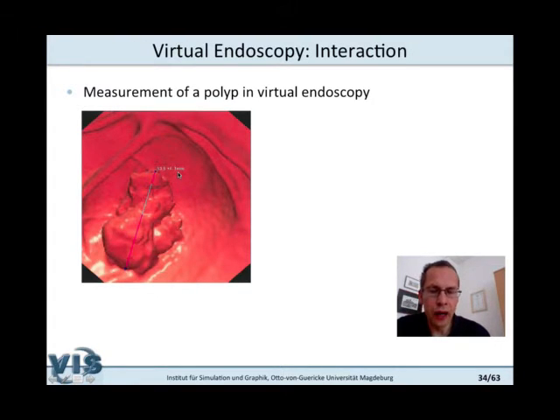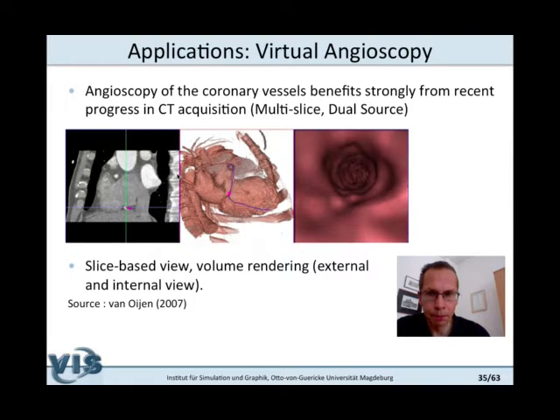Yeah, so optimally such information should be added to any measurement. And of course, this means that for a larger measurement, the relative uncertainty is lower. It's only 2%. That's not a lot. Yeah. If something measures 7 millimeters, then 7 plus minus 1 is another order of magnitude of uncertainty because the overall measurement is much smaller.